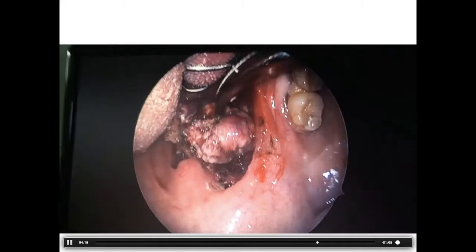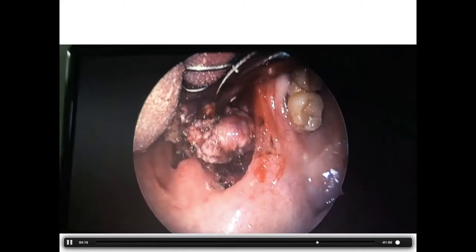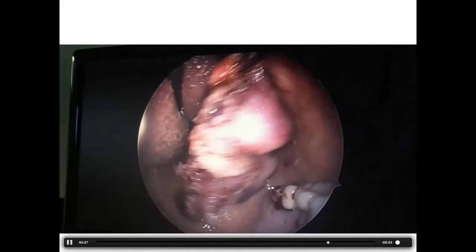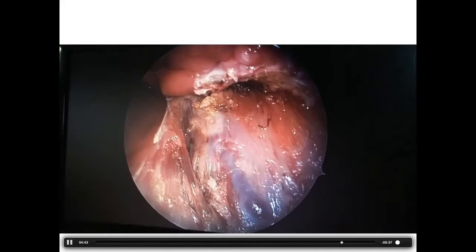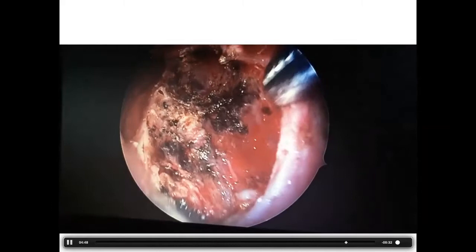The lesion was removed and came out as lymphoma. The paratonsillar vein is visible in the bed — the fossa is clear without any bleeding. Post-operative healing of the fossa was excellent.